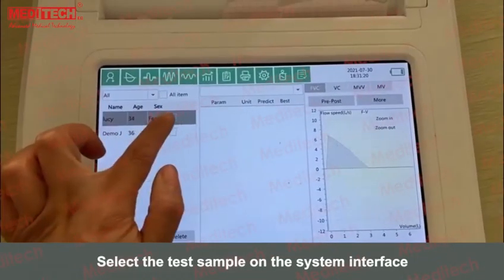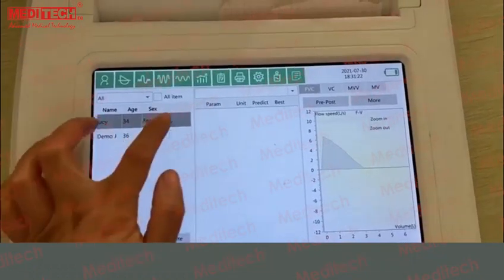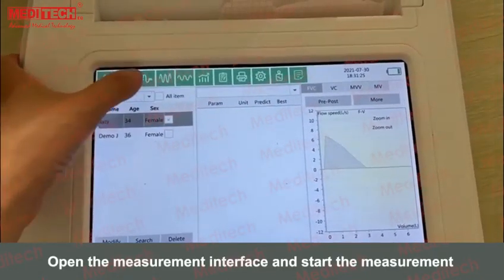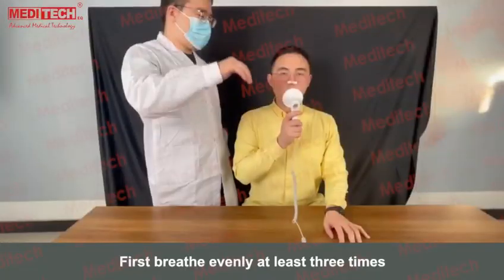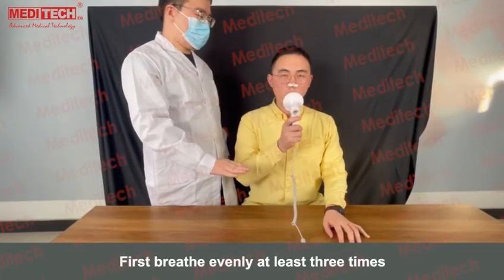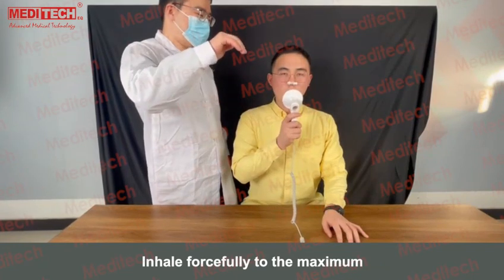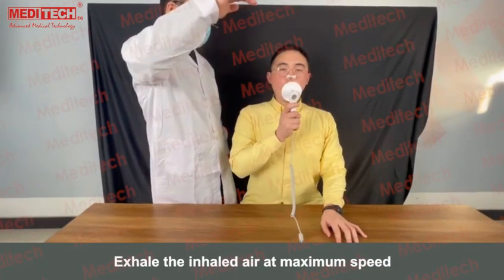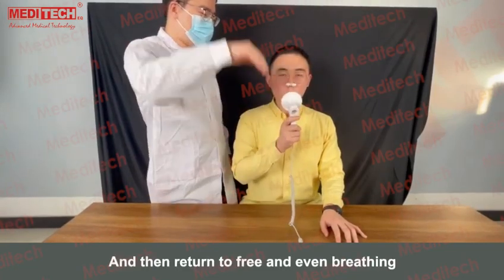Select the test sample on the system interface. Click on VC. Open the measurement interface and start the measurement. First, breathe evenly at least 3 times. Inhale forcefully to the maximum. Exhale the inhaled air at maximum speed, and then return to free and even breathing.